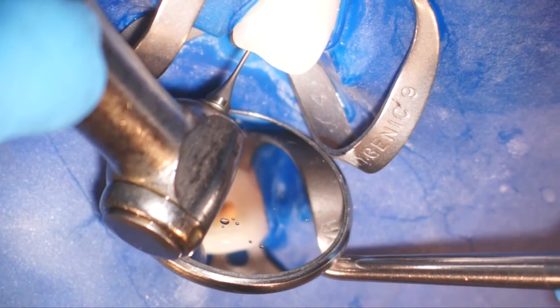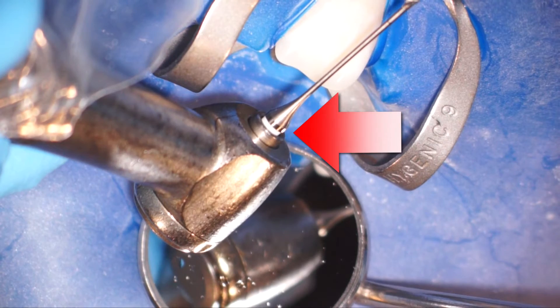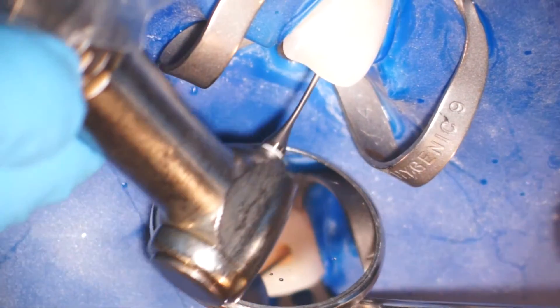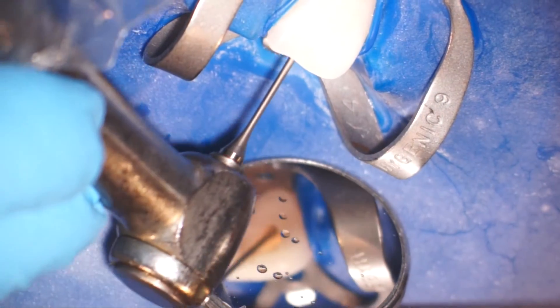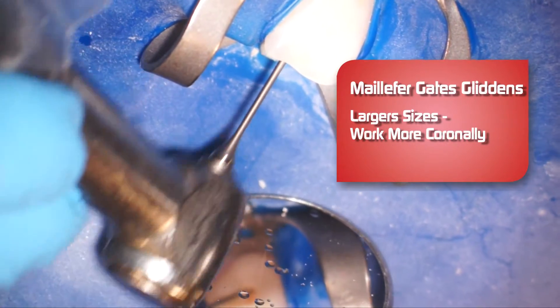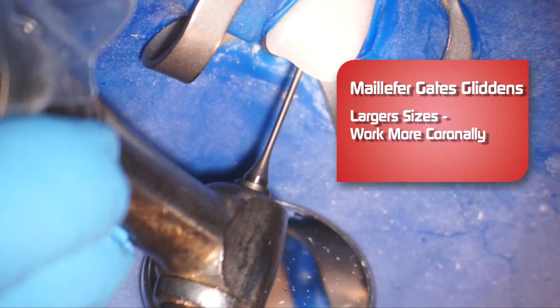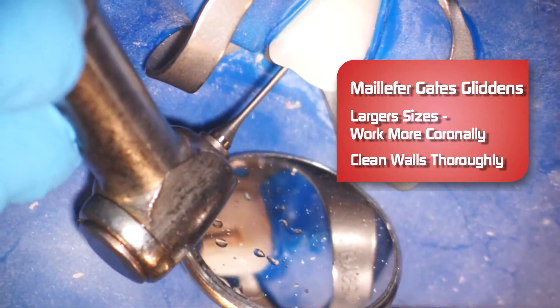So this is a number two Gates. And then we'll move to the number three Gates, and as you can see, you can see the white right there. So number three, and I'm using a number four Gates here. The larger you go up in size, the more coronally you're going to use it, so you're not going to go as far into the canal. And I'm really cleaning out these walls, making sure that there are no pulp horns left behind.